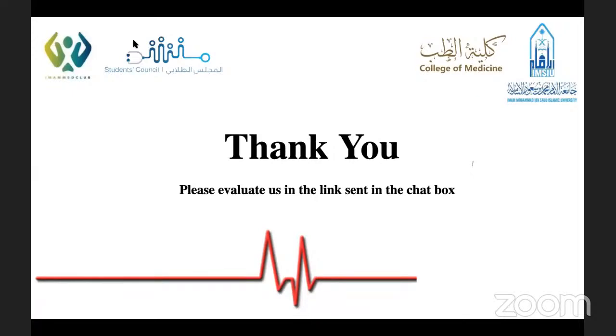ساينس أريثميا اللي قبل شوي شفناها إنها نورمال، بس مع التنفس زي ما قلنا. ليش؟ لأنه إحنا نعرف الحين حسبنا الريت وطلع الريت نورمال، so it's normal، بس مع زي ما قلنا التنفس.